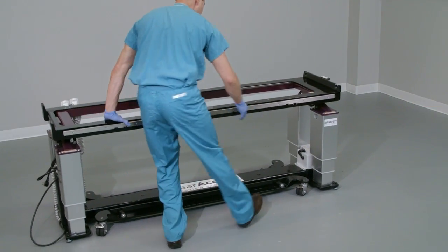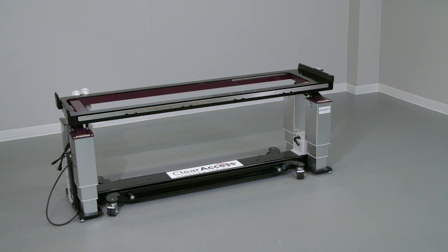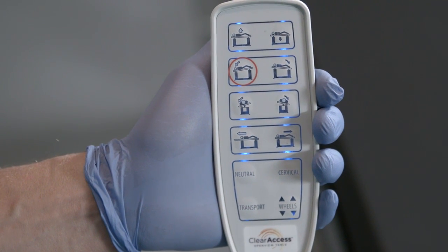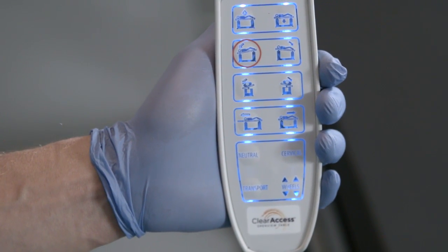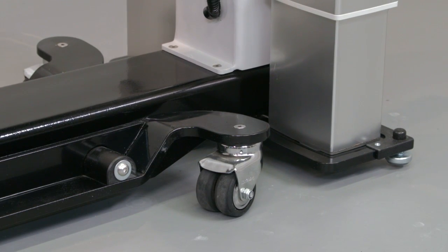Move the Clear Access table to the preferred location in the OR. To lock the table to the floor, press any button on the hand controller to wake it. Both hand controllers will auto-sleep if inactive for 30 seconds. Press any button to reactivate, then lock the table by pressing the wheels button firmly once and releasing. You'll note an audible beep as the table is lowered to the ground, warning caregivers to keep personnel and equipment clear of the table.